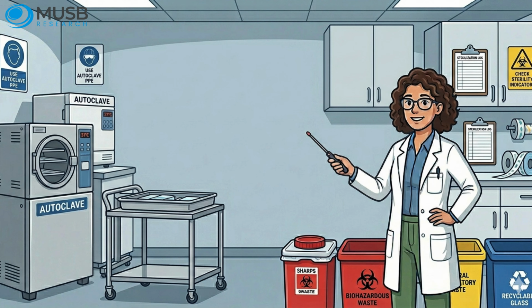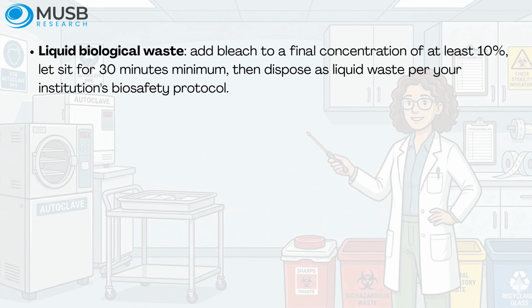When contamination does happen, and at some point, it will, your decontamination response protocol needs to be immediate and thorough. Liquid biological waste. Add bleach to a final concentration of at least 10%, let sit for 30 minutes minimum, then dispose as liquid waste per your institution's biosafety protocol.